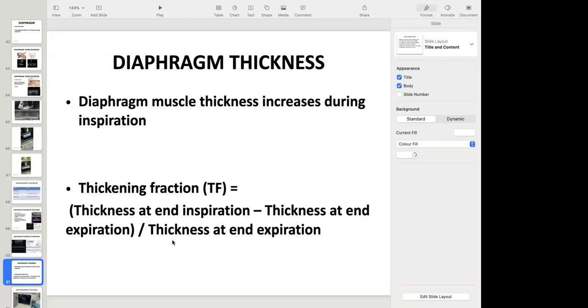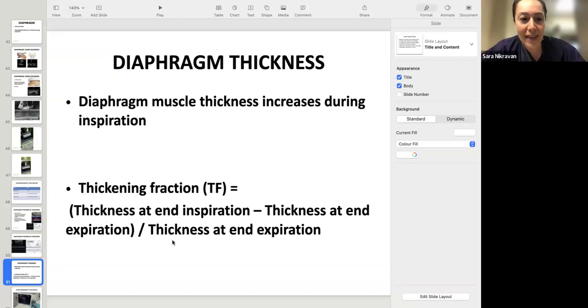And I know too, in the world of anesthesia, when looking at excursion, people are really interested in blocks. If you put in a block and you block the phrenic nerve, how is the thickening affected, and is the patient at risk of respiratory distress, or do you need to support them more? And Dr. Morris just said, I use it in pulmonary consult service a lot to evaluate dyspnea.